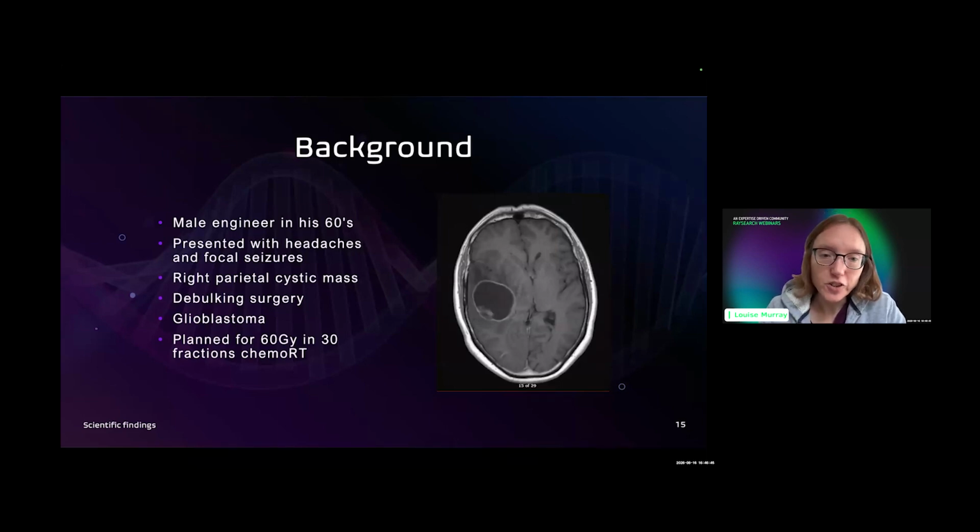As is standard after surgery, he was planned for 60 Gray in 30 fractions of radiotherapy with concurrent oral temozolomide chemotherapy.